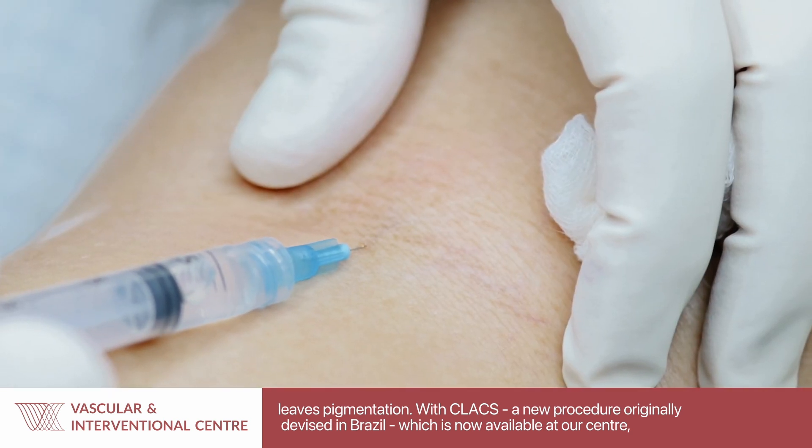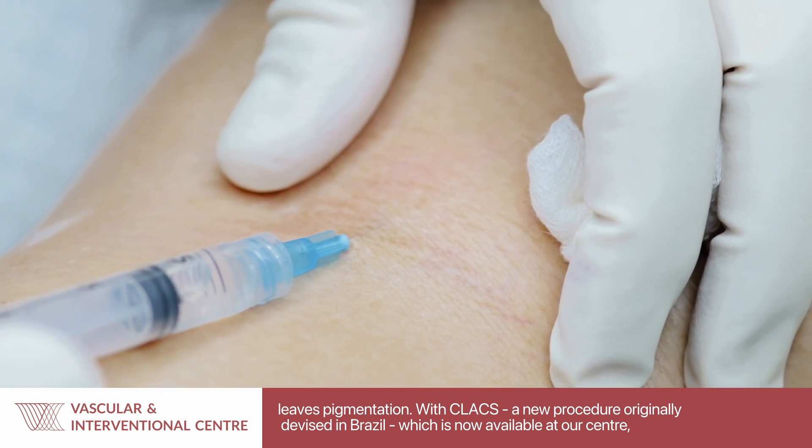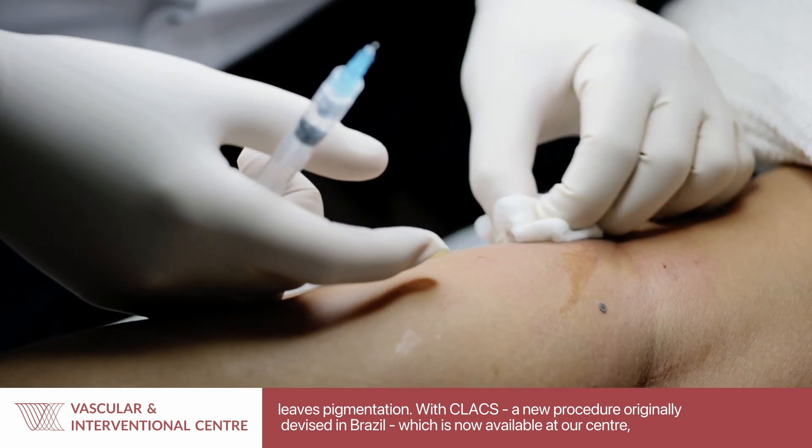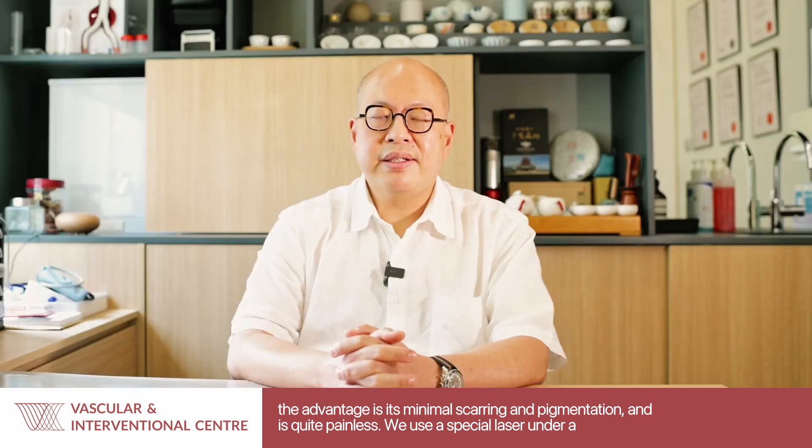With CLACS, it is a new procedure that has been devised originally in Brazil and which we now have available at our centre. The advantage of CLACS is that essentially it leaves behind very minimal scarring, very minimal pigmentation, and is quite painless.